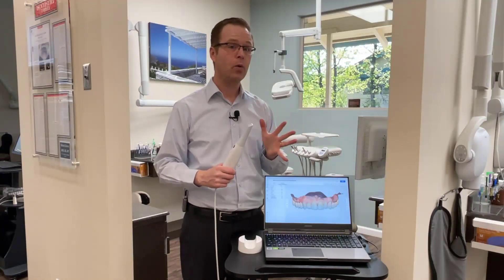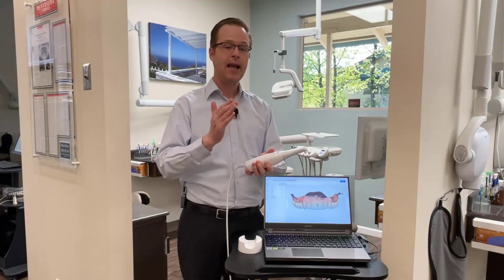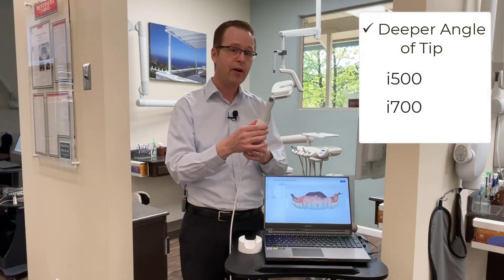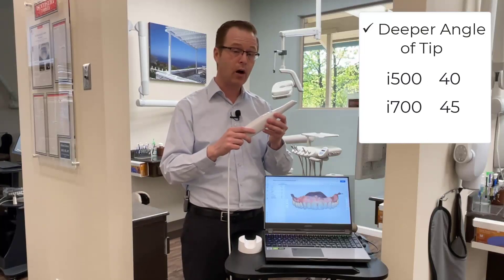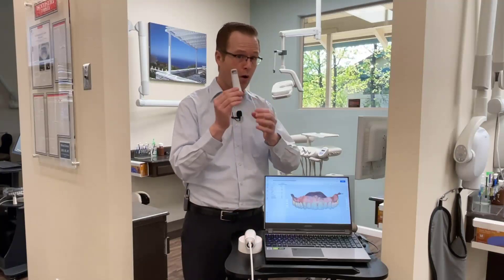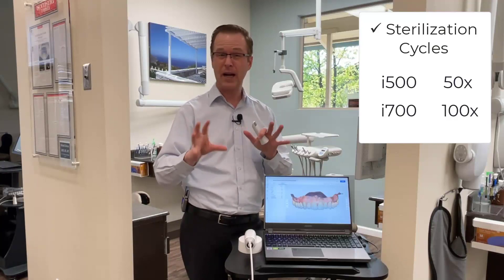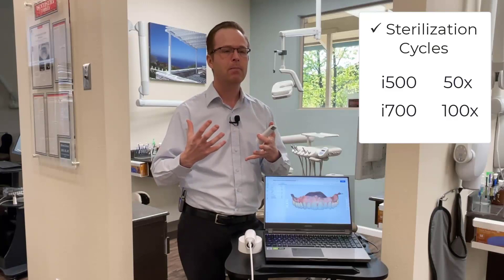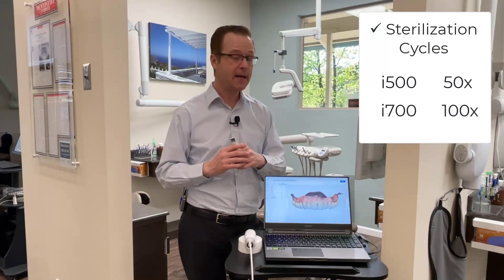Just like the i500, it has features we're used to with the Medit scanner, such as the anti-fogging tip and 3D in-motion video technology — it works very similarly. However, it has an additional five degrees of angulation on the tip itself: the i500 has a 40-degree angle tip and the i700 has a 45-degree tip. They've basically rebuilt the hardware — it's smaller, lighter, and the tip is made out of some pretty strong material. The original i500 tip Medit says you can autoclave up to 50 times, but they're now saying the new tips can go double that — approximately 100 autoclave cycles. That's pretty cool, especially since these tips can be expensive compared to other intraoral scanners with very expensive tips.